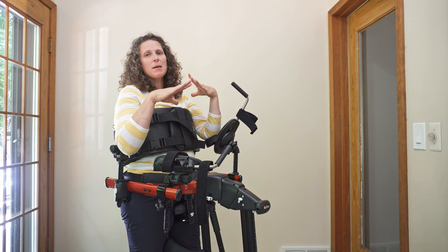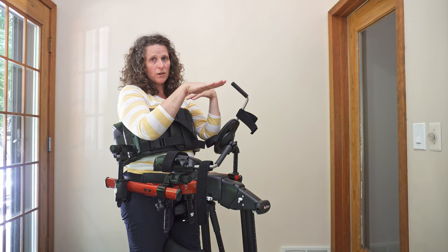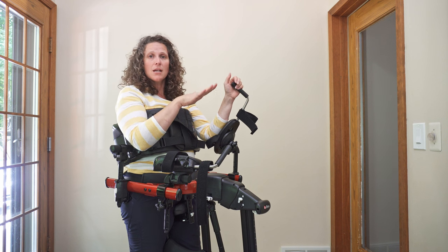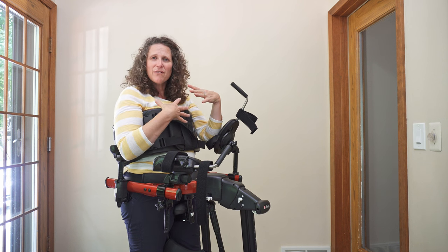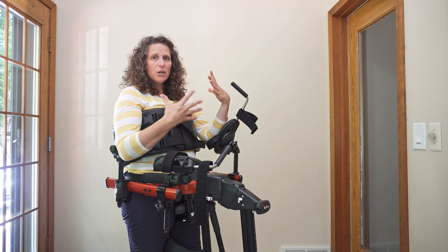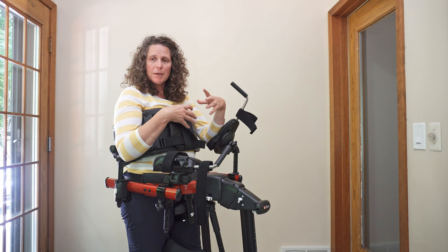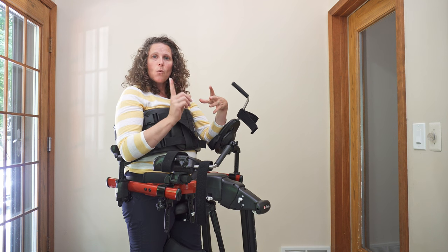As they progress and get stronger in their trunk, maybe they don't need their pelvis as far forward with as much posterior pelvic tilt. Play around with that, feel what it feels like on yourself, put your individual in the pacer, and look at making adjustments one thing at a time to make them more comfortable.